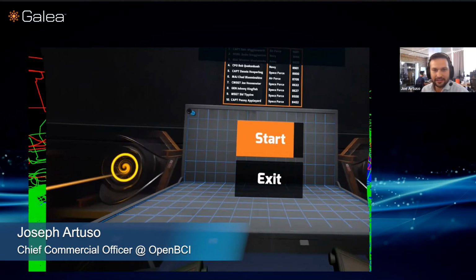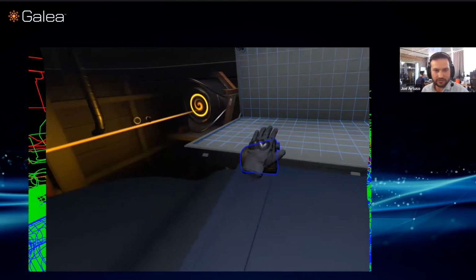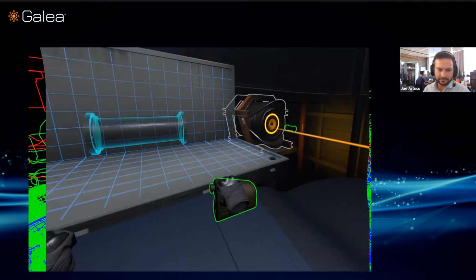I've also got Phil and Musa with me today, and we're going to show you some of the latest developments that we've been working on internally with Galea.